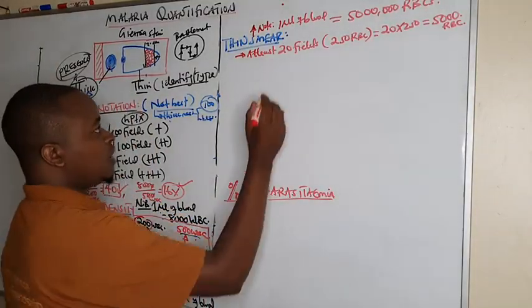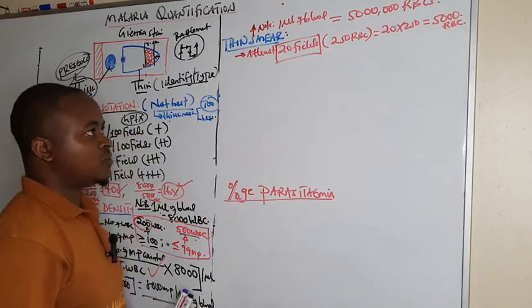So those are the at least 20 fields we are talking about.